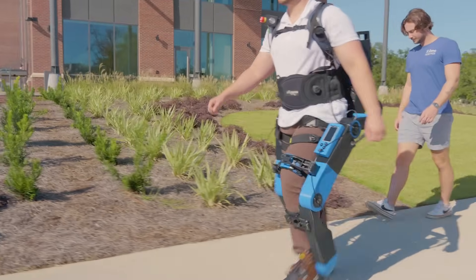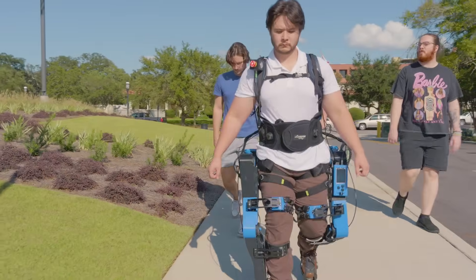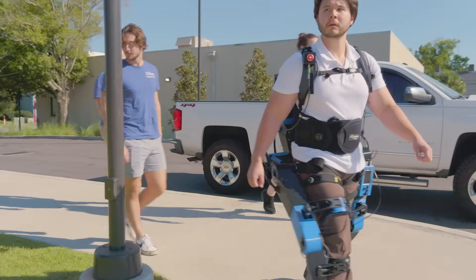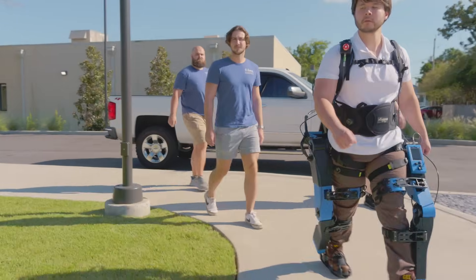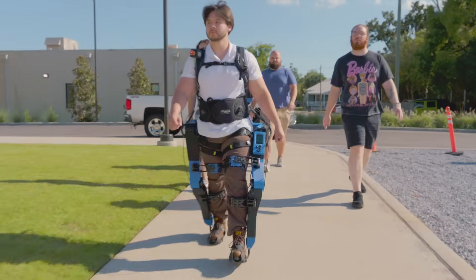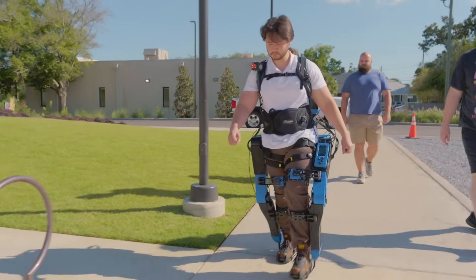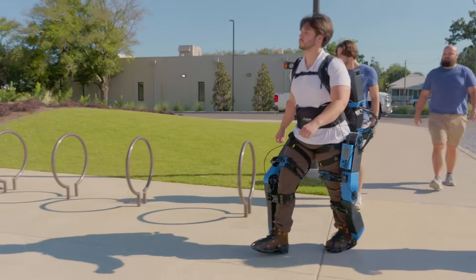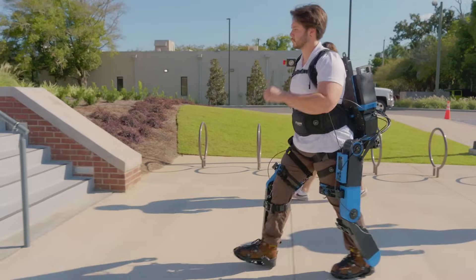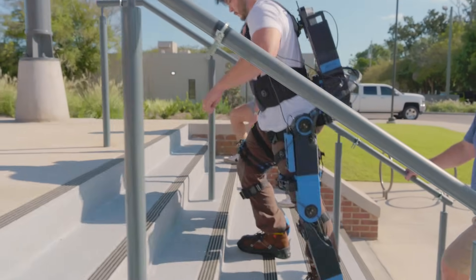We are continuing to advance to actual field usage, and going outside like this is a big first step. One of the cool parts about our work at IHMC is that we're always trying to find ways of improving the human condition. With exoskeletons, it's a really good bridge between robotics and human performance, and there are a lot of avenues to apply our knowledge in robotics to assist those doing hard jobs in the real world, which I think is amazing.